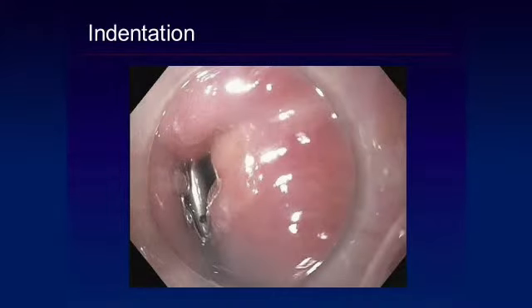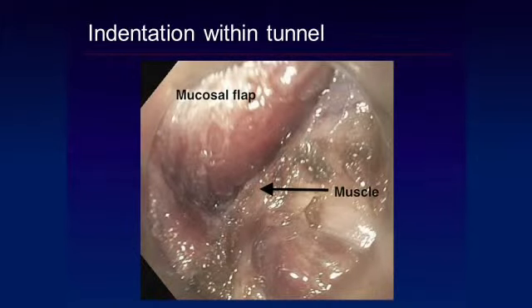It was not the intention of our study to compare the 2 methods, though we believe that the 19-gauge needle is superior as it endures less costs and consumes less time. In fact, performing intraprocedural fluoroscopy added only an average of 2 minutes to the total procedure time. The reason for the transition from using an endoscopic clip was that in one patient the clip caused indentation of the mucosal flap of the submucosal tunnel and made the myotomy challenging. However, the clip was simply removed and the procedure continued, but this prompted us to devise the 19-gauge needle method.